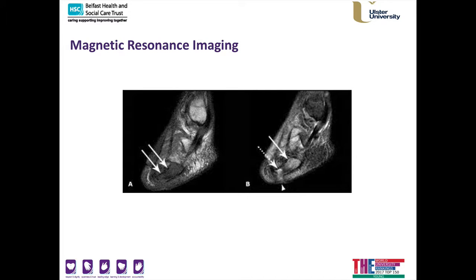However, if you then show me this MRI scan, as a vascular surgeon, I will struggle to delineate whether there's an infective cause here. So I do believe that the radiologist is absolutely vital to present appropriate images following MRI imaging, and also to provide their expert opinion, particularly for images such as this.